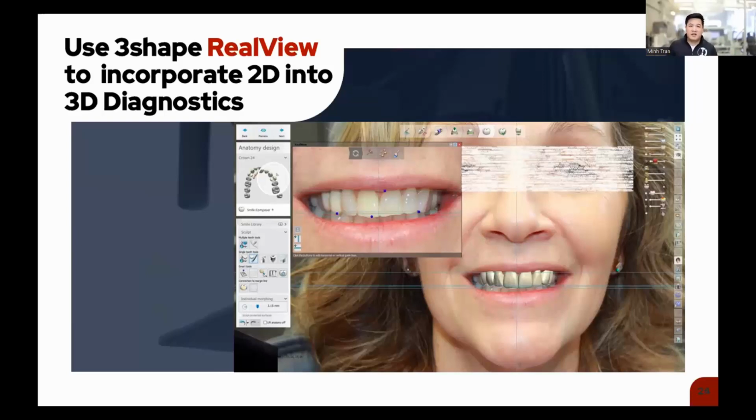And with these digital diagnostics, I'm approaching the case from a very prosthetically driven mindset. Nowadays, I design what the final prosthetic would really look like, right? So using prosthodontic principles, understanding what the clinician is hoping to achieve. And we adjust this diagnostic in the mouth, right? So once it's done, it's sent to the clinician, they're able to adjust it in the mouth.